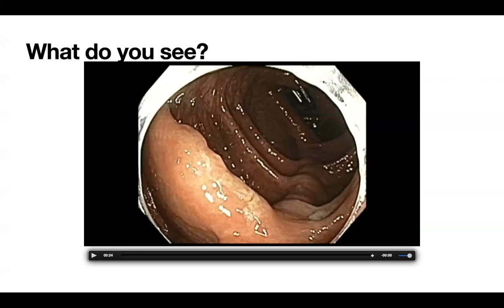No matter what approach I take, it is important to include it in the report. What did we do for the rest of the colon? Have we examined it or have we not examined it? That will help the next endoscopist, the implied requirement for screening the rest of the colon. Otherwise, each of us who does endoscopy will fulfill our primary goal of dealing with the main polyp and then forget the rest of the things, and that will be of no advantage to the patient, although the patient is saved from the main polyp.